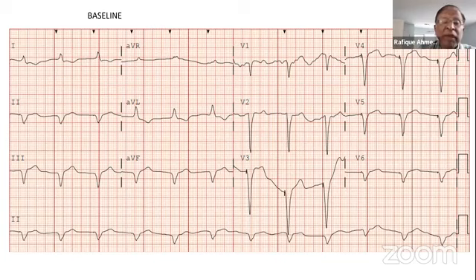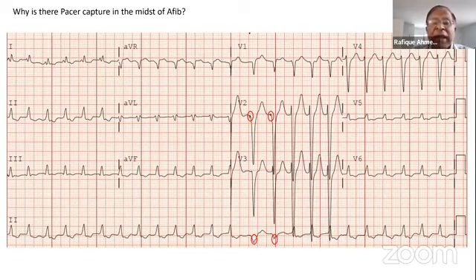Second, if there is a pacemaker, what is happening? If somebody has any supraventricular arrhythmia, it will track it before it mode switches. So it is possible that there was some kind of atrial arrhythmia that was tracked and paced at a higher rate, and then it mode switched and is no longer present, because then it goes to a fixed rate pacer. And the problem you're facing is that you see these spikes only in V2, not in other leads. That happens with pacemakers, because nowadays with bipolar pacemakers and different kinds of filtration, you don't see spikes. So that's it. Thank you.